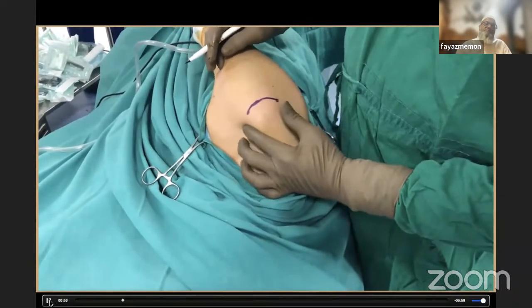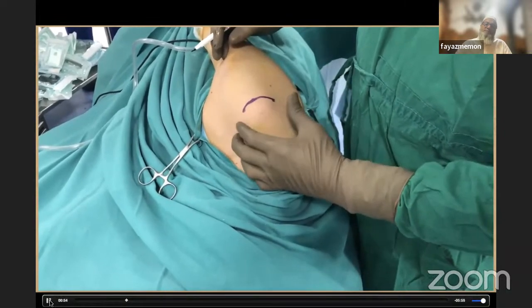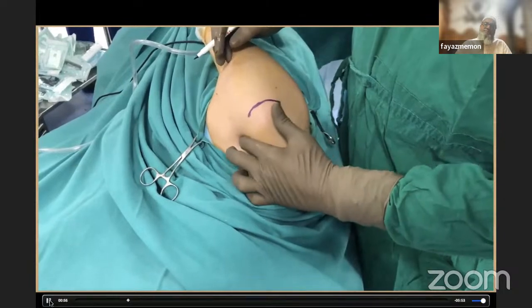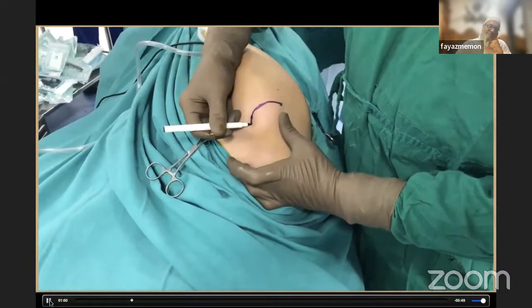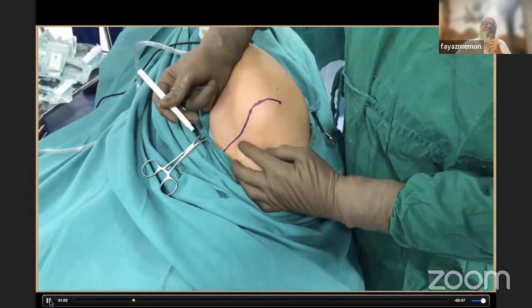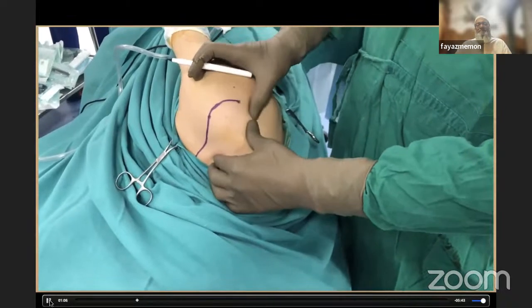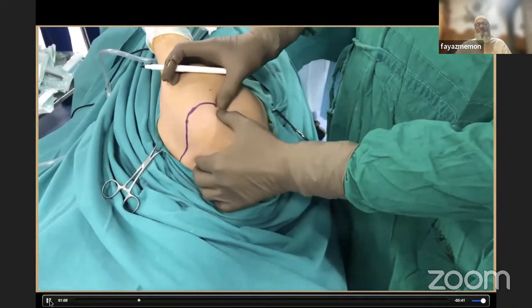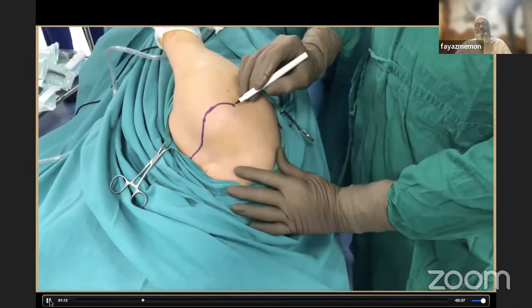Now here you can continue palpating. This is the acromioclavicular joint. Here you palpate the concavity of the clavicle and extend your marking over there. And then here you can find the continuity from the first point that we took for the spine of the scapula.